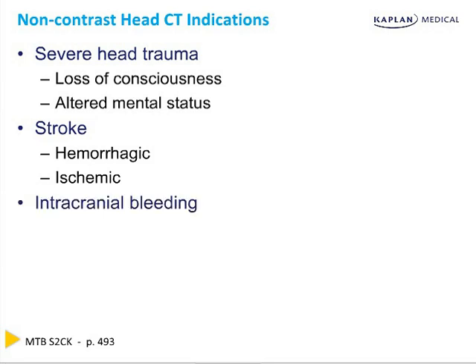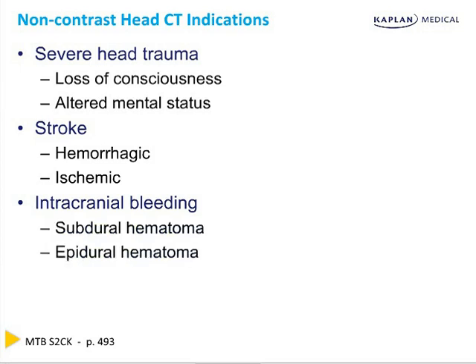Finally, brain bleeds are also best evaluated with a non-contrast head CT. So if you suspect that an elderly patient who fell and hit their head has a subdural, or if you get the classic epidural story of a young person who was hit in the temple and lost consciousness, then had a lucid period before again losing consciousness, you must evaluate with a non-contrast head CT.